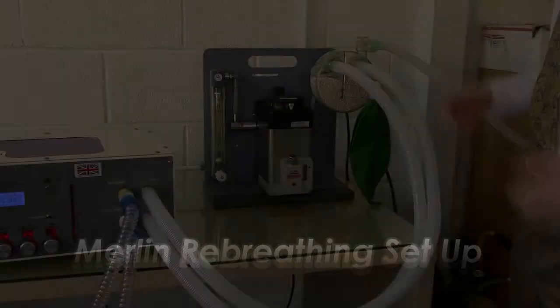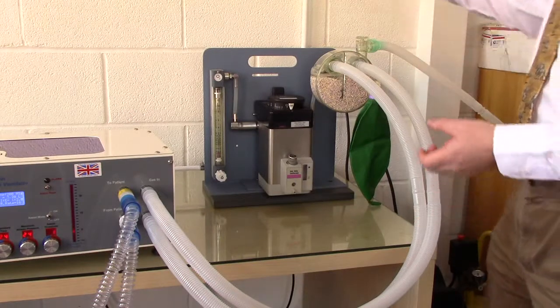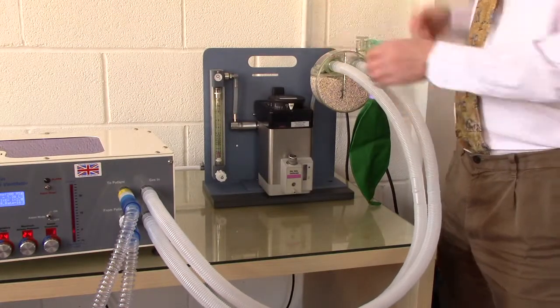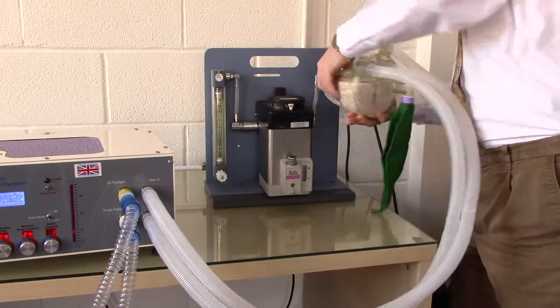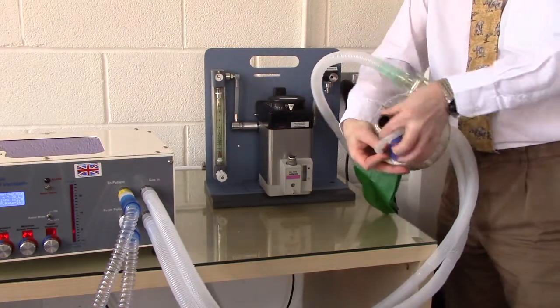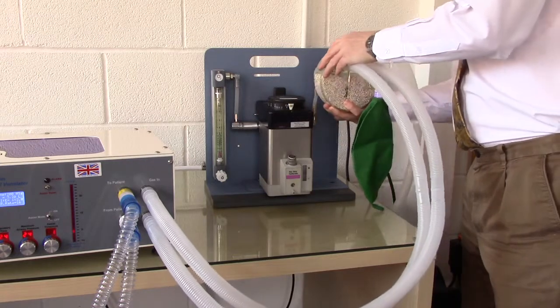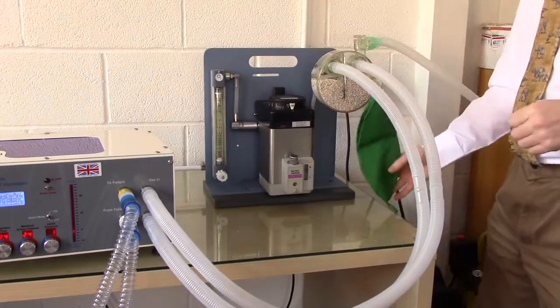This video illustrates Merlin's setup in a rebreathing or circle configuration. What we have here is a fairly typical circle system, which is fed by a single flow from the fresh gas outlet into the back of the circle from the 22mm FGF outlet.